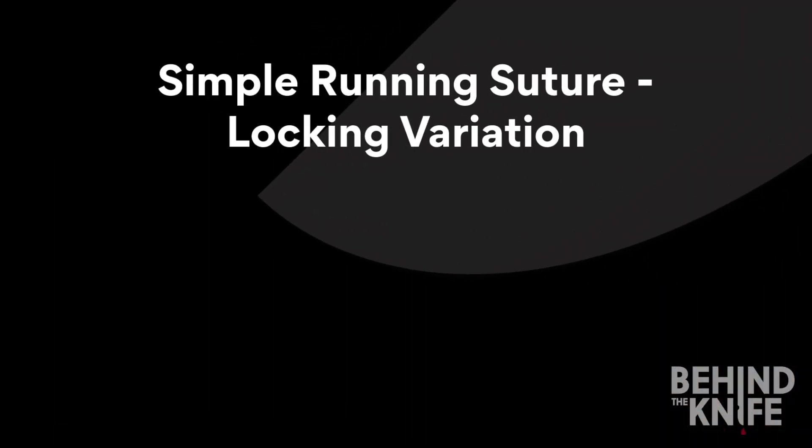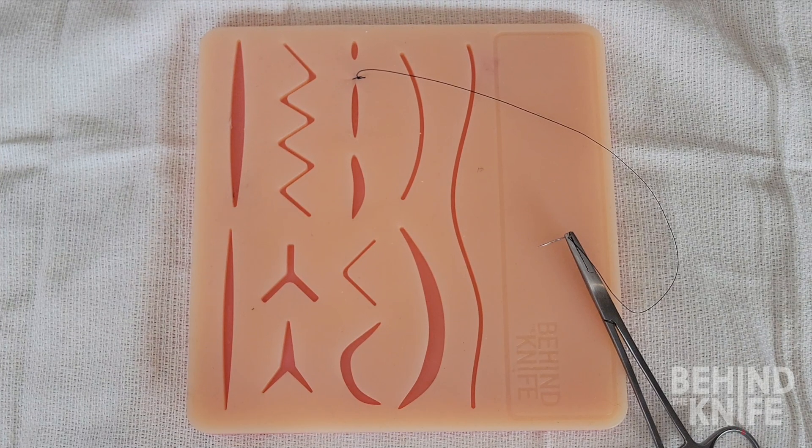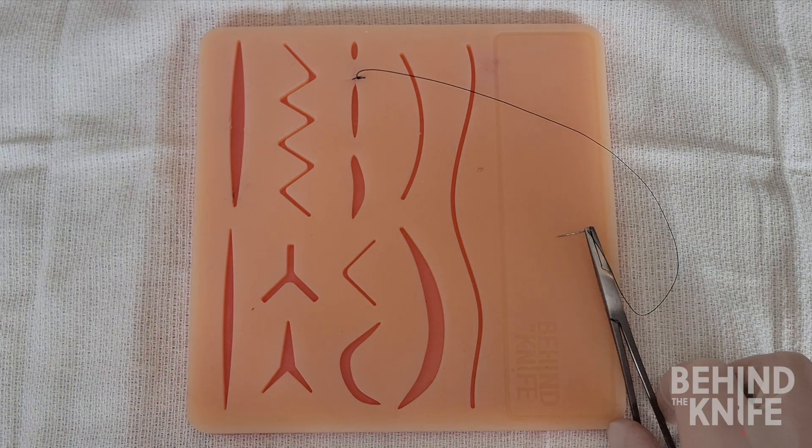If you would like to throw a simple running locking suture you will start the same way as the non-locking simple running suture with tying your anchoring stitch at the top of the wound.